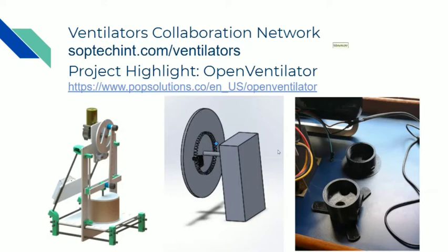Level 4 is when the patient doesn't show signs of getting better, so they need really big precision on the volumes and pressures inside the lungs, the ventilation flux, and the ventilation rate between inhalation and exhalation. This will all be done by the Arduino, and I hope we can assemble these in the next days and go testing on Monday or Tuesday.